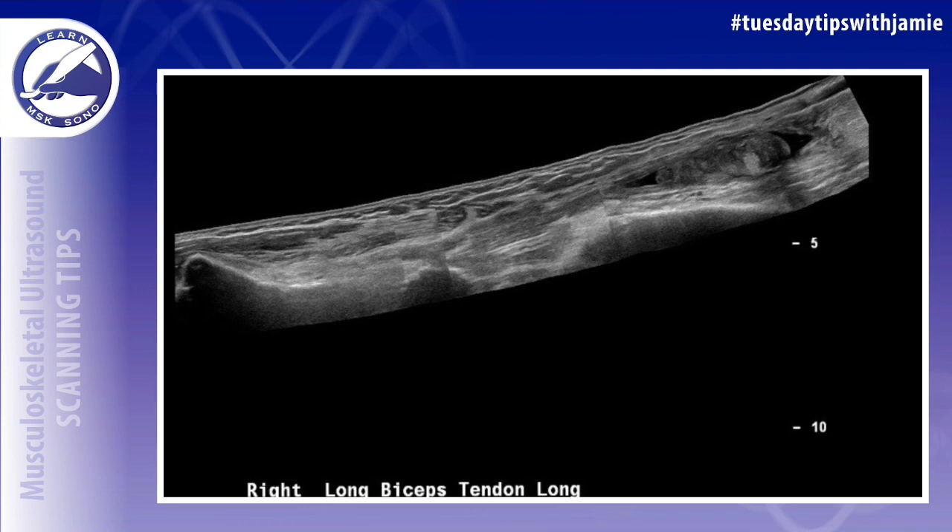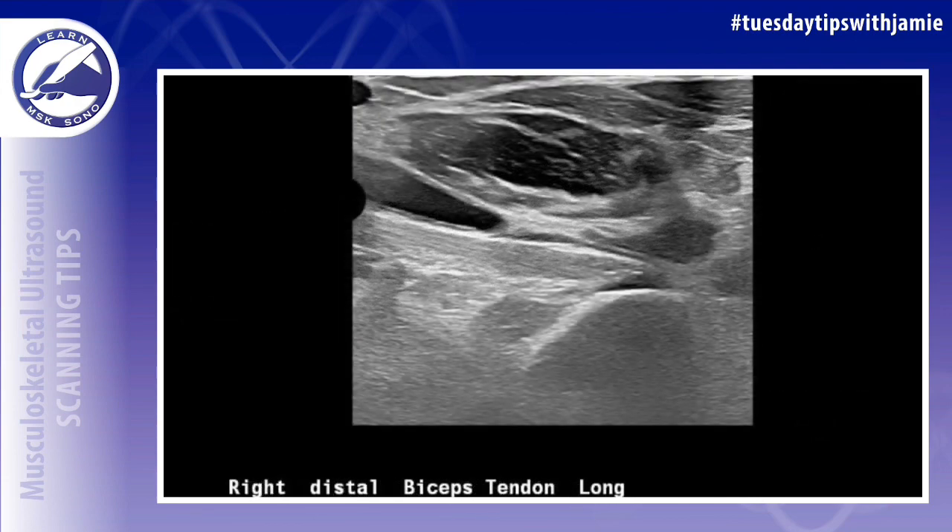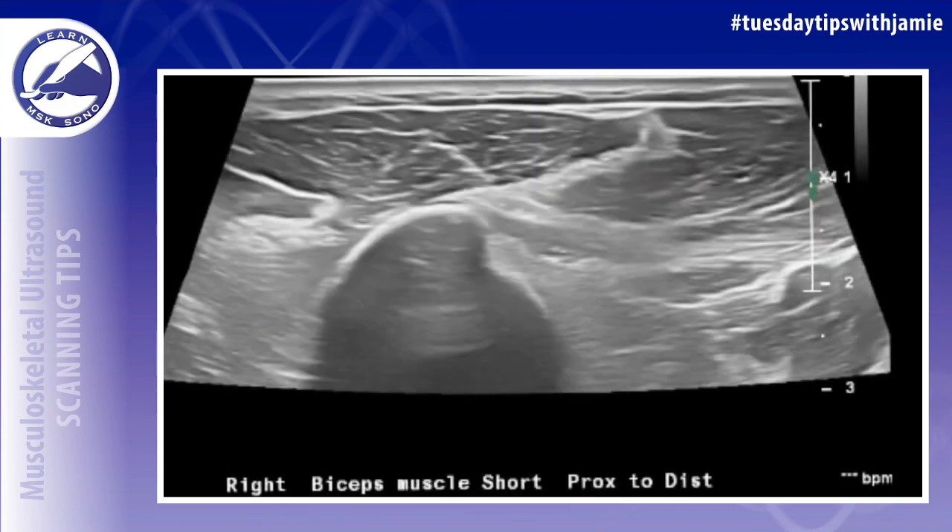When there's a rupture you always want to attempt to locate the retracted biceps tendon and then take a measurement — like in this example — from the area where the biceps tendon should arise from the joint until the area where the tendon stump is visualized. You want to document this distance.